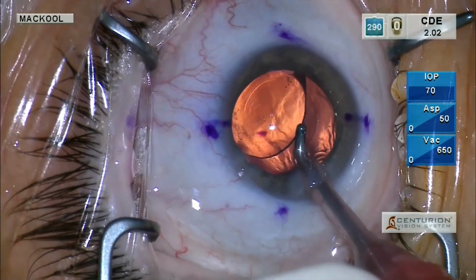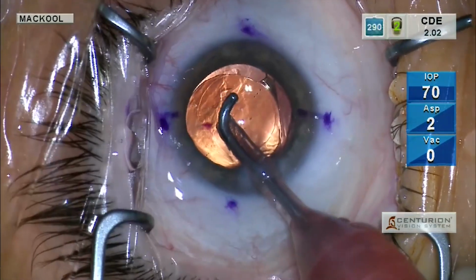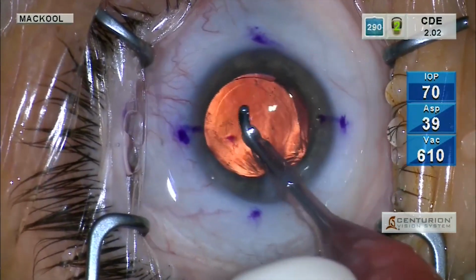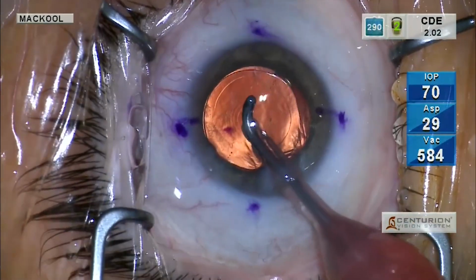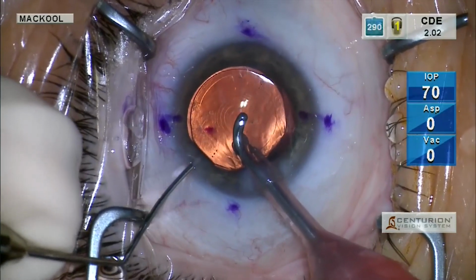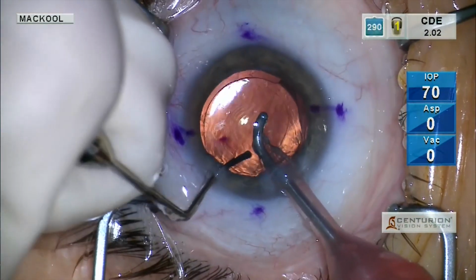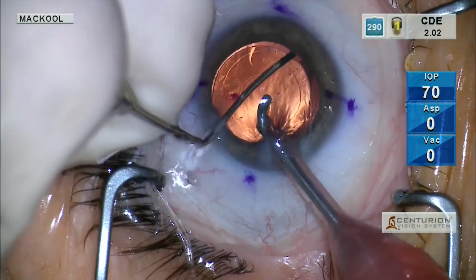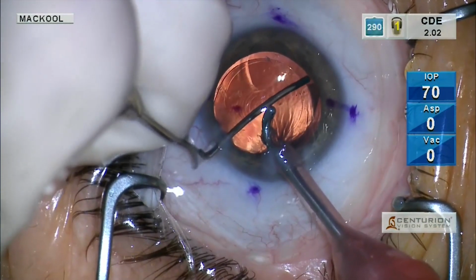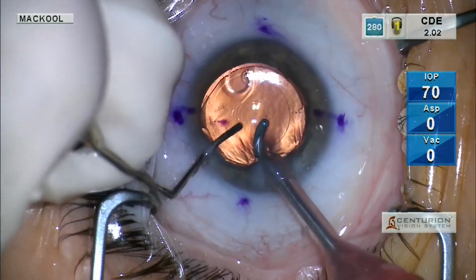Once that's done, we can slip into the anterior chamber and remove the OVD from in front. And then lastly, keeping the I/A tip in the eye to maintain intraocular pressure, we're going to rotate the intraocular lens into the final resting position to treat the astigmatic component of the refractive error.